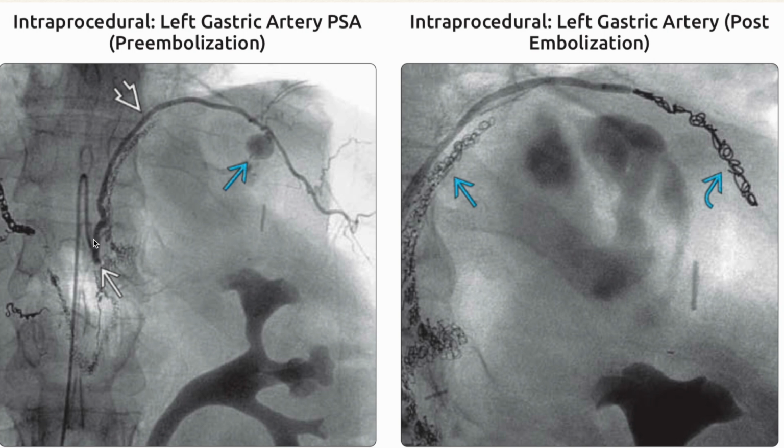Here a SIM1 catheter is used and we have hooked the left gastric artery, and that is showing a pseudoaneurysm in the mid part. So here you will always have to go distal to it, and then you should start coiling distally, then at the neck and proximally.